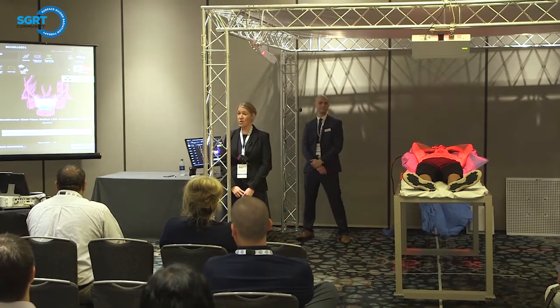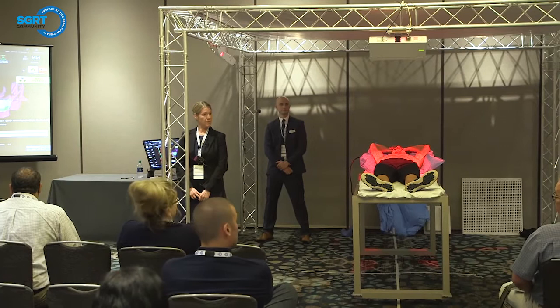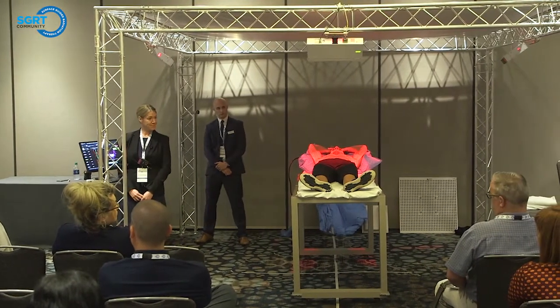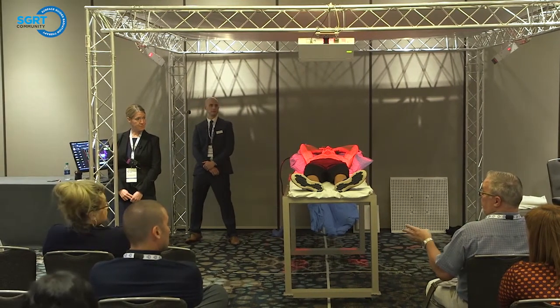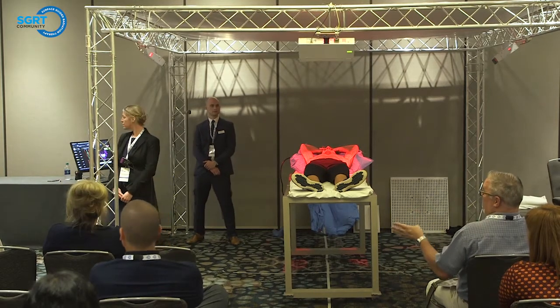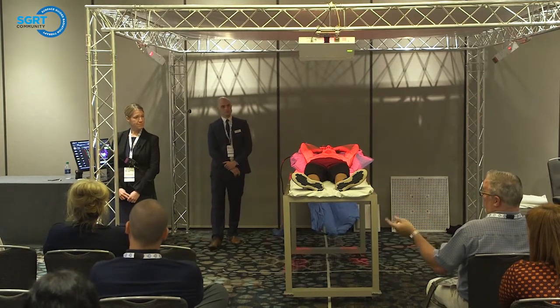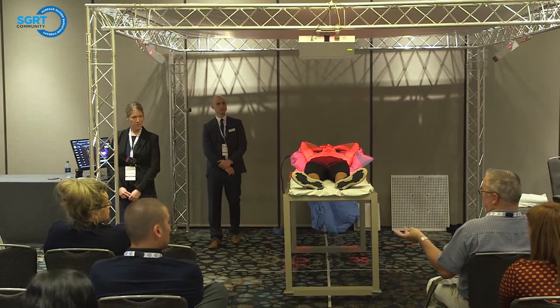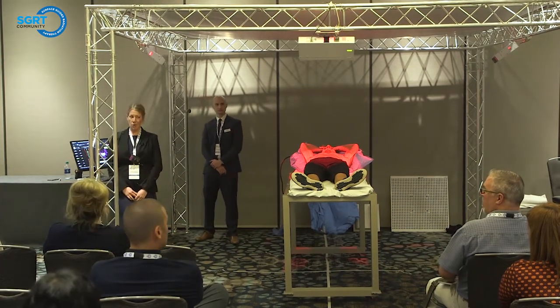Okay, so any questions on the SBRT workflow? As far as your screen, when you're setting up the patient and you turn on your lights, do you have any shortcuts, or is it always true with pitch, up or down, roll, whatever side it's on, or rotation? It should, it's always the same.